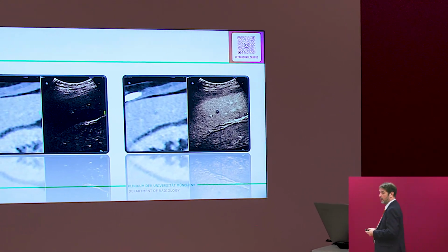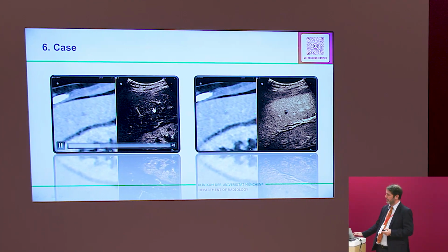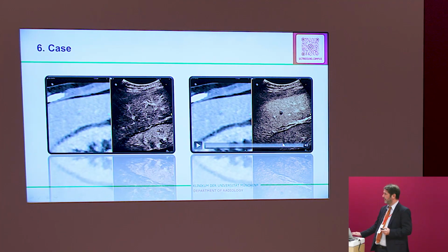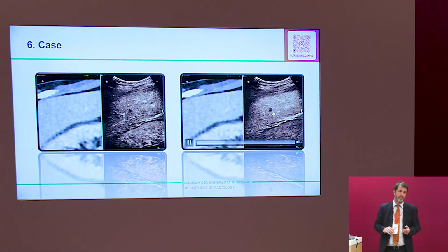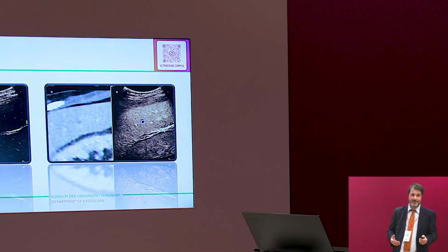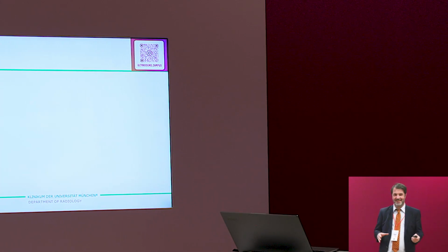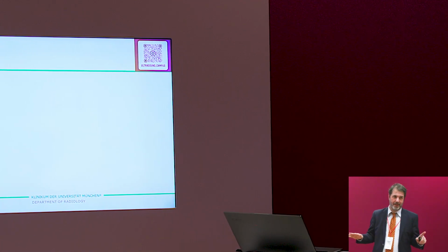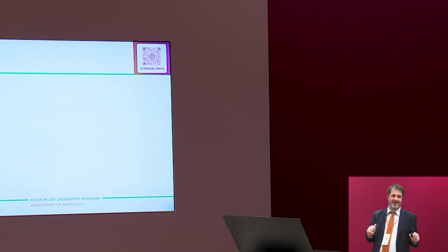So in the next step, we go to the contrast. You see there's a marker, there's a lesion, and you still see in the follow-up it is dark. Even a lesion without any uptake will be what kind of lesion? No uptake, no contrast inside. No contrast during the whole examination, so not alive. This is a cyst. Cyst. Yeah, you got it.